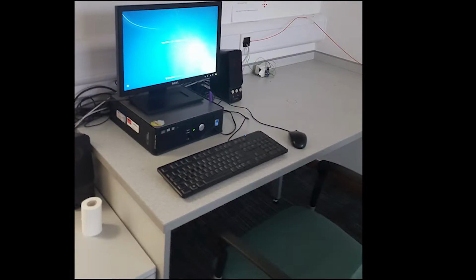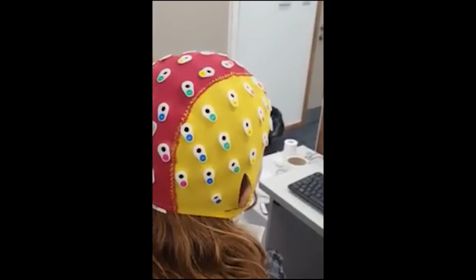Here is an EEG experiment step by step. First of all, the participant is seated in the room in front of a computer, and once the experiment is explained to them, the experimenter will measure their head for size. An EEG cap, which is best suited to them, is placed on their head and fastened.